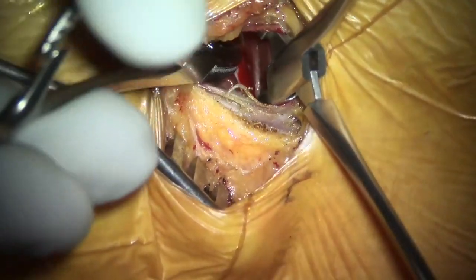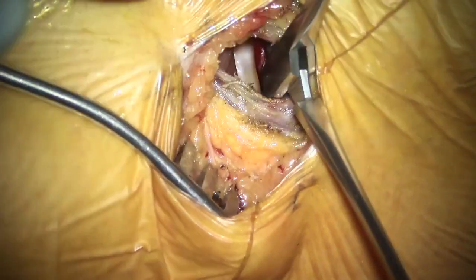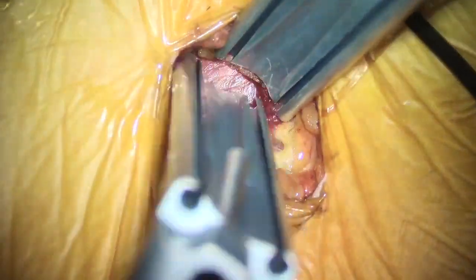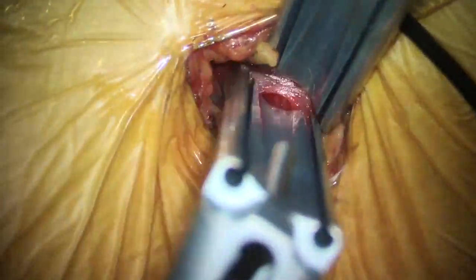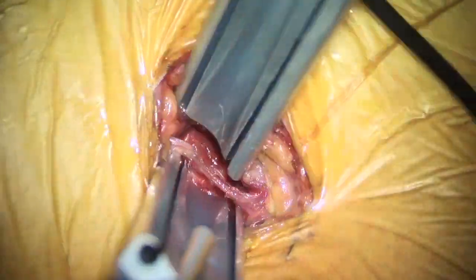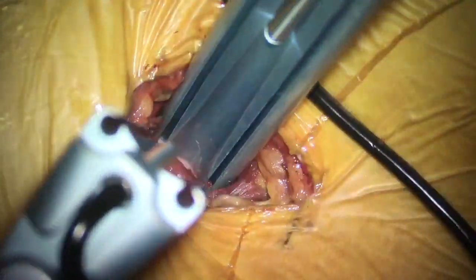You just have to split them open using your artery forceps. Once you create an opening between these two layers, the third layer will be the transversus abdominis, which is very thin and flimsy in most people at this level. You can see the direction of the fibers of the external oblique and internal oblique.